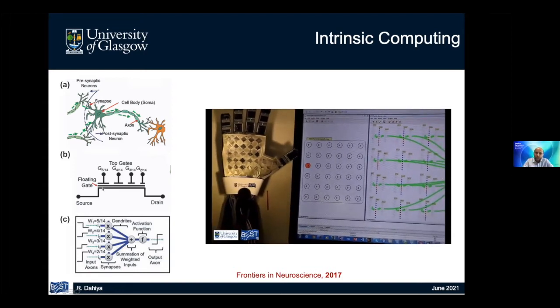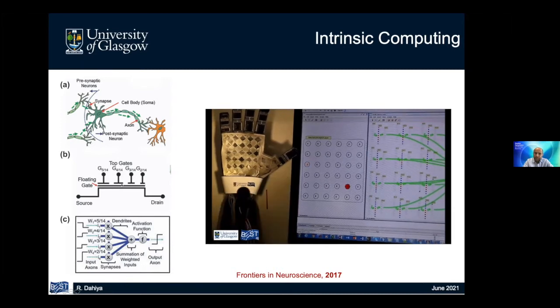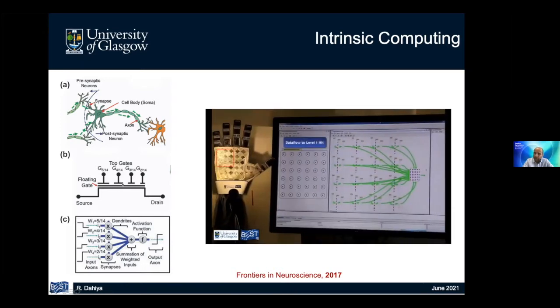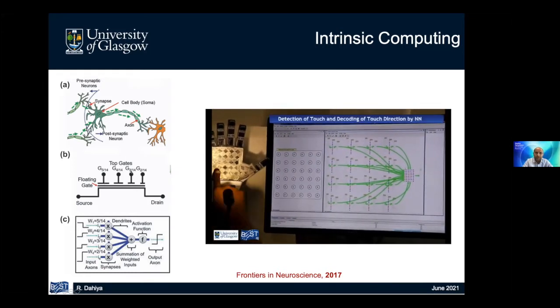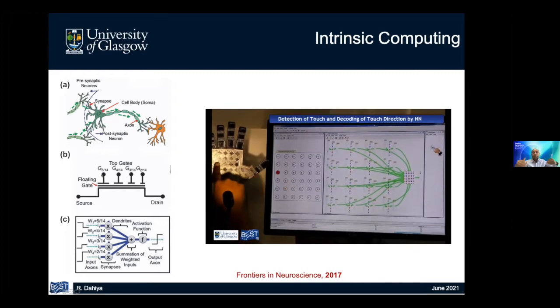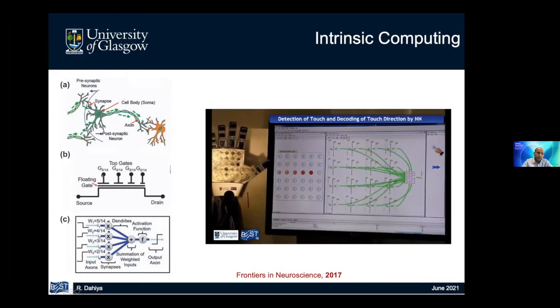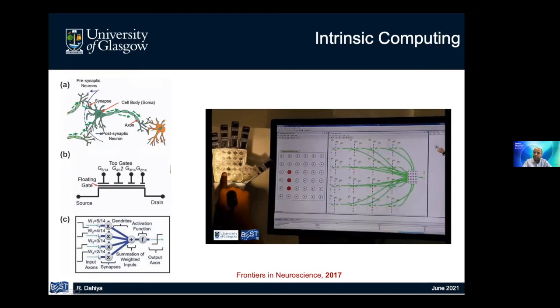Now, on that electronic layer, if you make multiple gates, and you can define these gate widths, it can be hardware, because it's hardware implemented, it's hardwired. So you can define these gate widths in advance and then realize the gate. It can work like a synapse, as you see here. So you have multiple gates. These inputs can be coming either from electronics prior to this device, or directly from touch sensors.